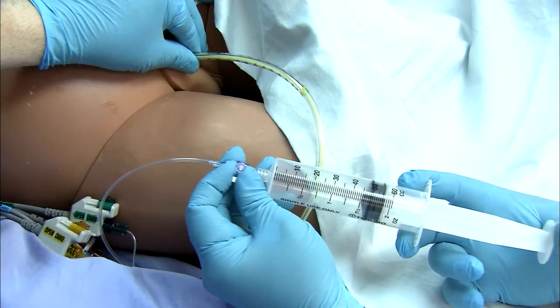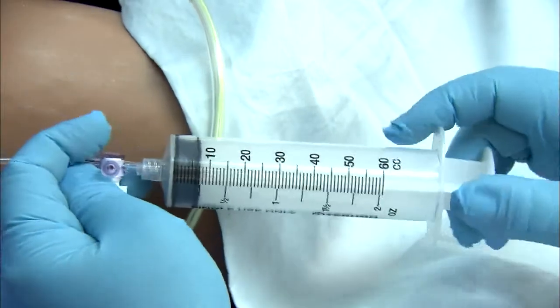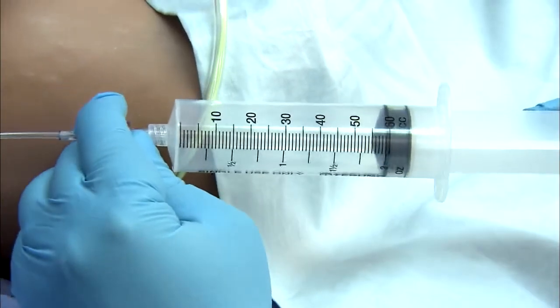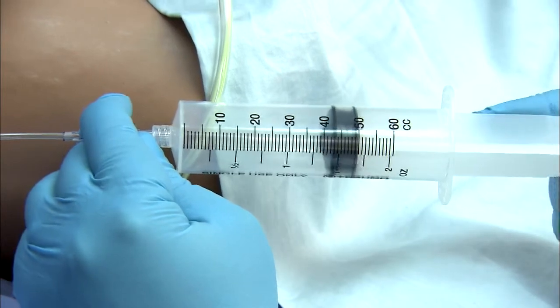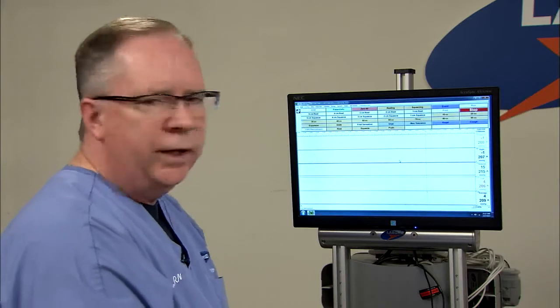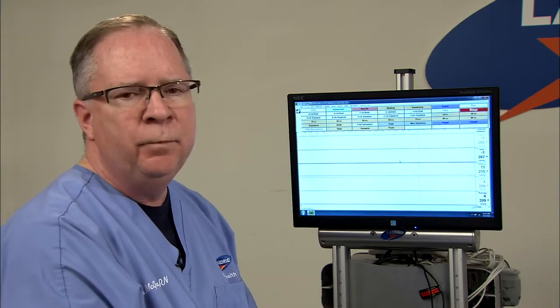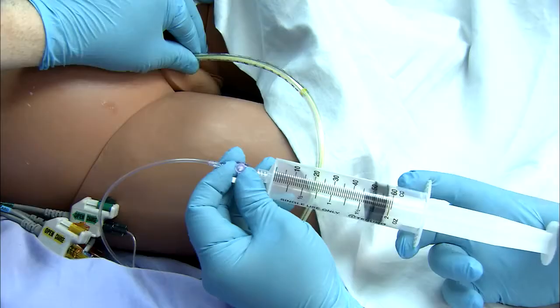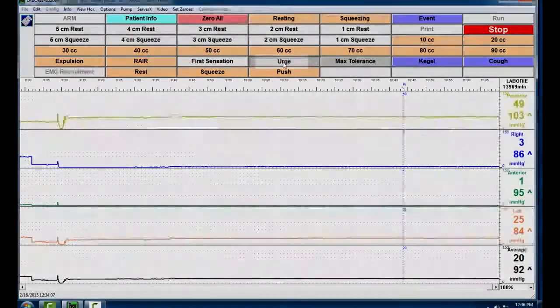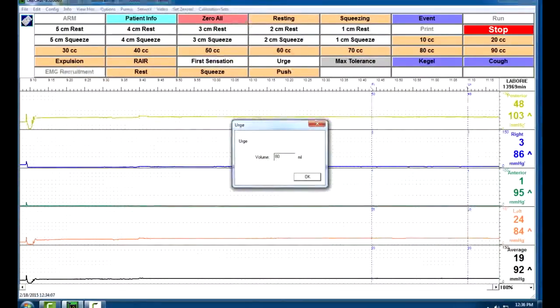Once you've got a full syringe of air in, you've got to turn your stopcock so that you close the air off to the balloon so that the air doesn't escape. Refill your syringe with another 60 cc's and then start to infuse more air into the balloon until they have an urgency feeling, until they tell you they feel urgent, that they need to have a bowel movement. Measure at that point what the volume of air is that you've injected. So let's say it's at 80 cc's. Go ahead and click the urge button on the control panel, enter 80 cc's, and then click OK.